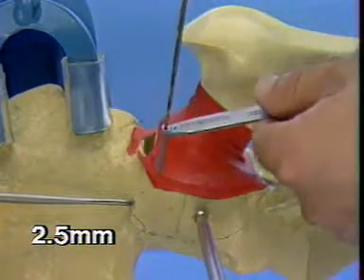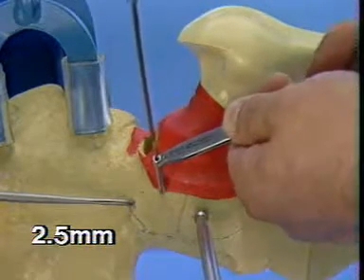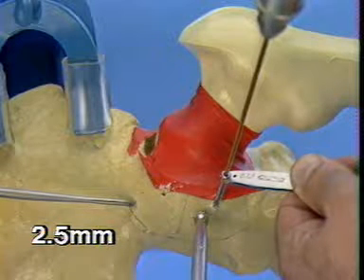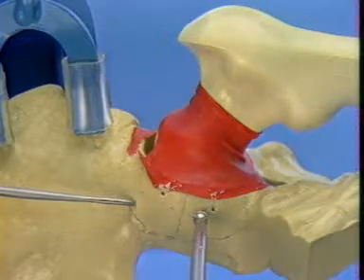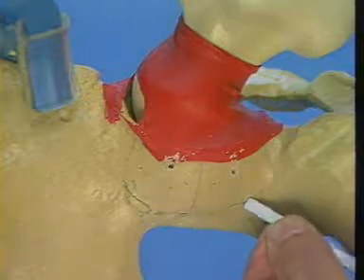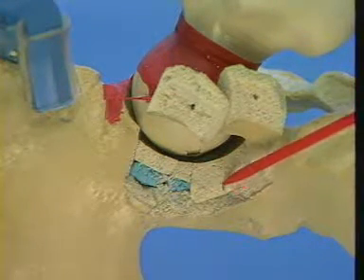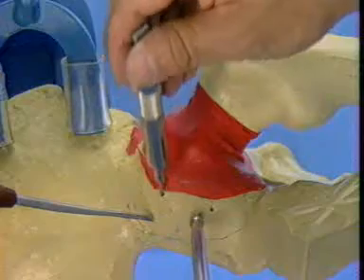With the patient in a lateral position, the 2.5 mm drill bit is directed vertically in order to avoid entering the joint. After drilling both holes, it's often advisable and quite instructive to redisplace the fragments of the posterior wall after drilling the hole, in order to make sure that the screws will be outside the joint. The depth of the holes is measured.